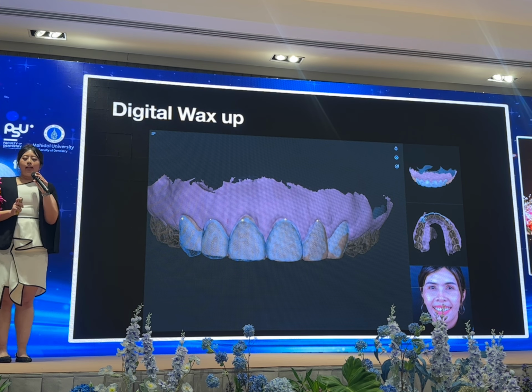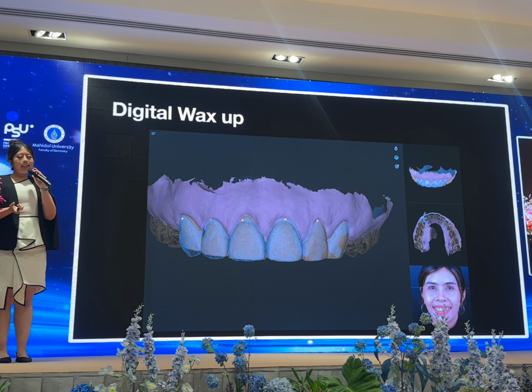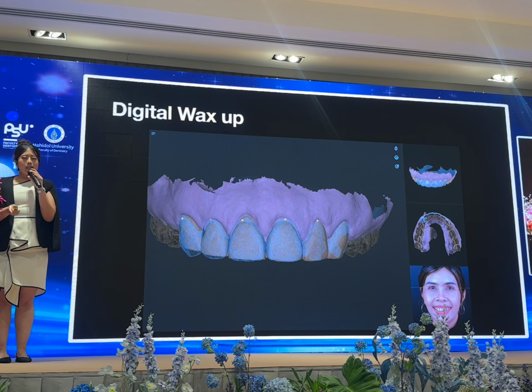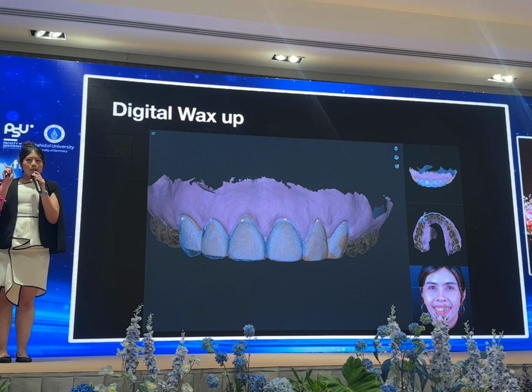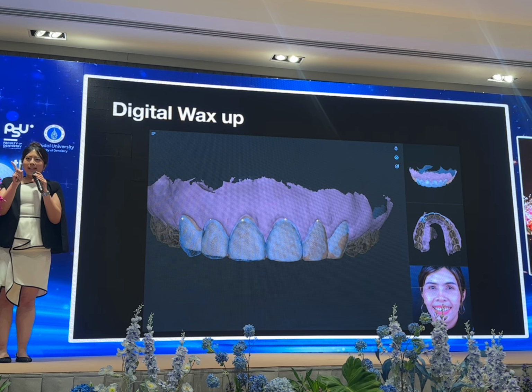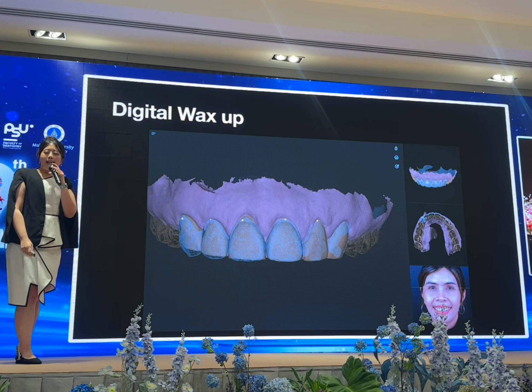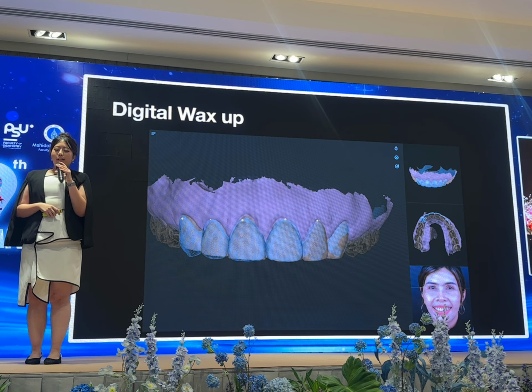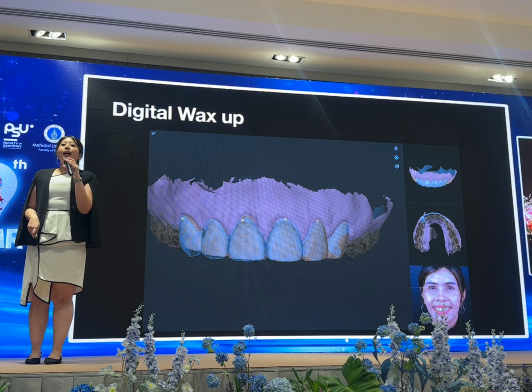This software can integrate the data, the model, the CT file, and we can use it to do a digital wax up. And we can just shoot our little finger like this to drag it and see every part of it.